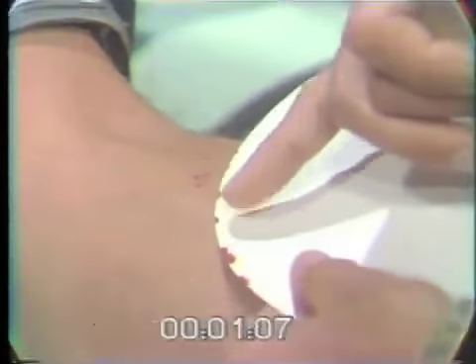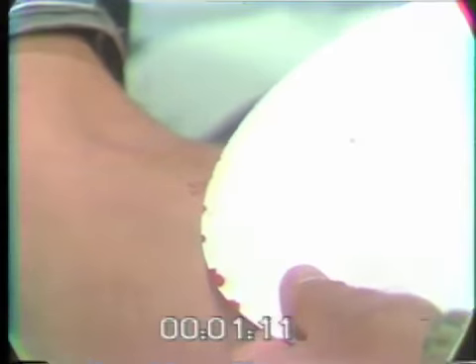About another 15 seconds, and you will notice that the bleeding has stopped at this point and is gradual at this point. You can see this because the blood was very large and then gradually diminished down the spots.